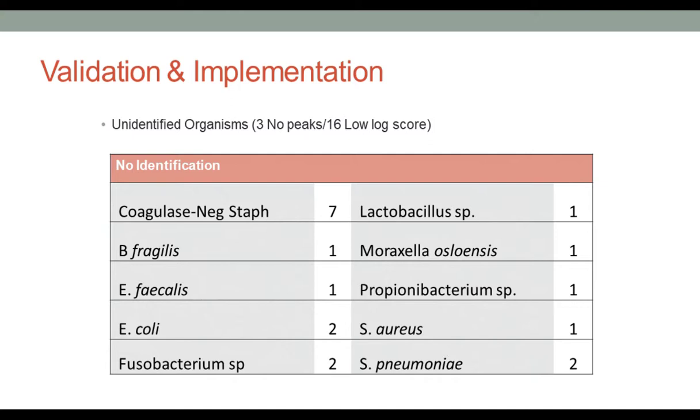I'm sorry, did it say the rates of the identification? Yes, the rates of the identification. Okay, so it's actually fairly similar. When you look at the list of organisms that I showed on my PowerPoint, those 10 or so organisms account for about 75% of the organisms that we see.